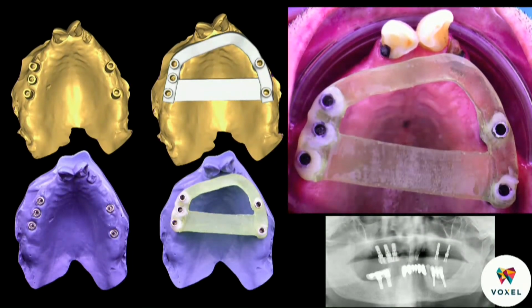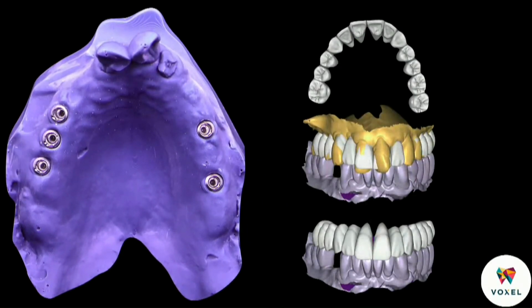I still don't have a very accurate explanation for why this happened. My personal input, knowing how the algorithm works with scanners, is that there is a problem with scanners shifting from one side to another by crossing the midline. This is where I think some source of error is. So by maintaining the central incisors, I think we facilitated that shift between both sides and crossing the midline. Again, this is my interpretation. I could be wrong, but things worked out very well in this case.